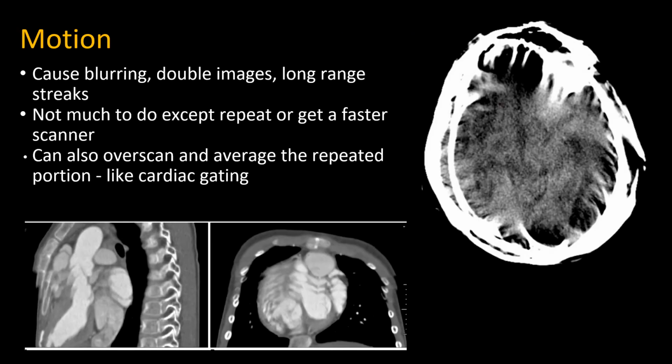Motion is an artifact that we're all pretty familiar with. And the fix for motion is usually just to repeat the scan, or you could get a faster scanner.